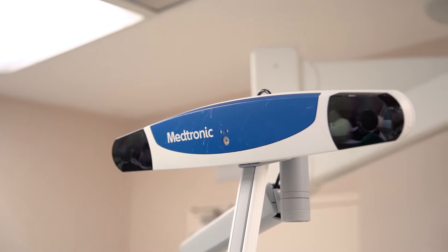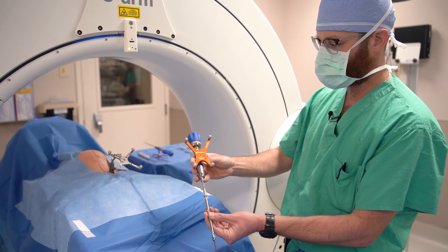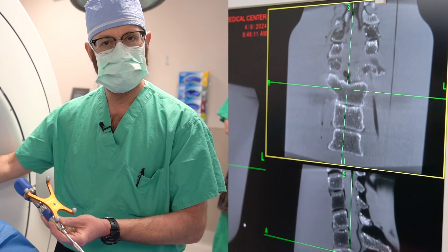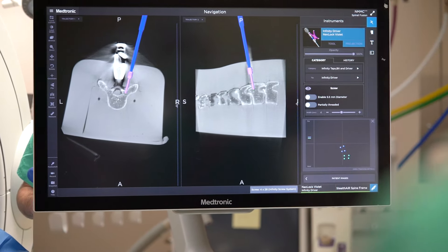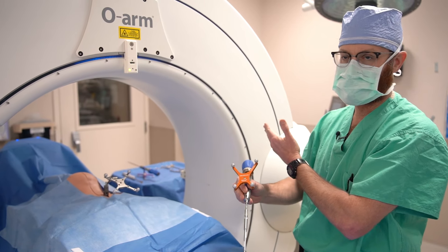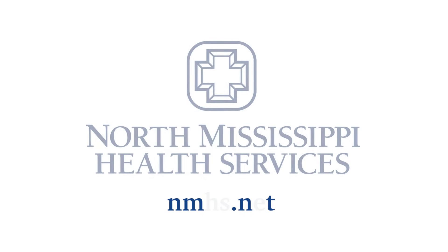This camera knows in real time where this fiducial is. We also have instruments that have the same tracking system with the infrared camera. Because of this, we know where the spine is within millimeters, and I know where my instruments are. Once the O-Arm gives us some three-dimensional pictures — the intraoperative CT scanner essentially — we'll be able to place instrumentation by making very small incisions without making big incisions.